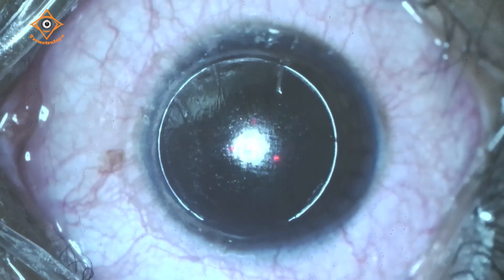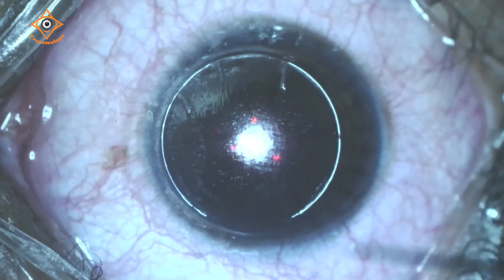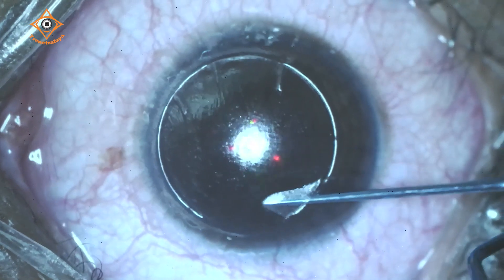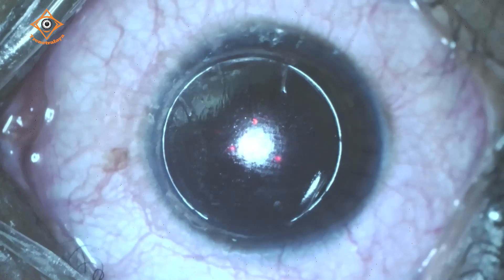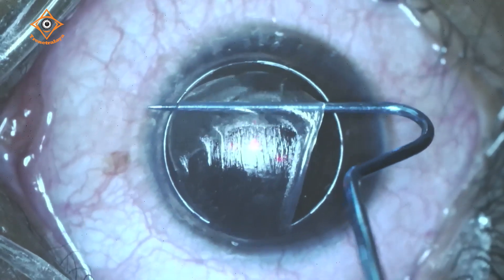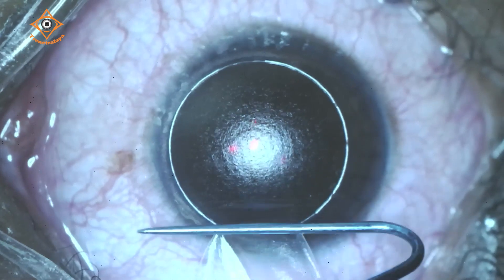I agree entirely — I would also prefer not to lift the flap until I am under the excimer platform, and then lift the flap. Now, is there any big difference? It is just that some stromal hydration changes could affect the refractive outcome — that possibility is there. So now I have lifted the flap.